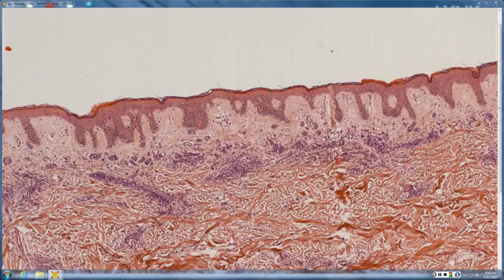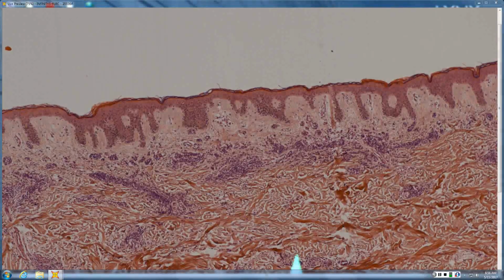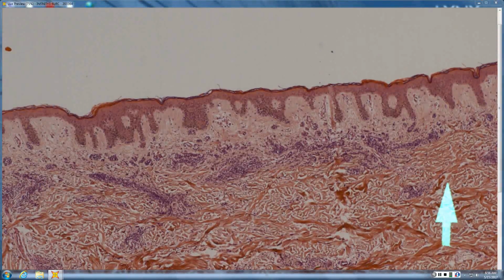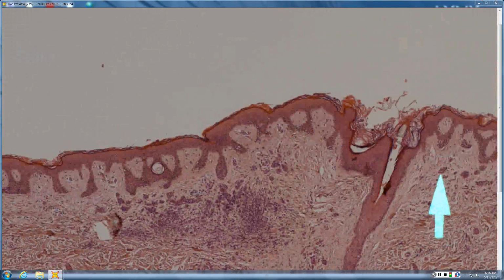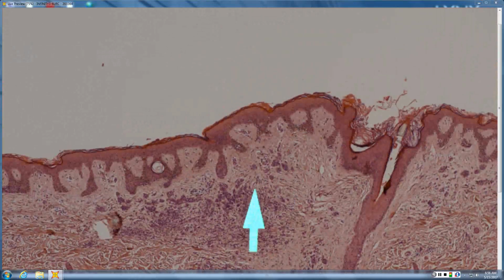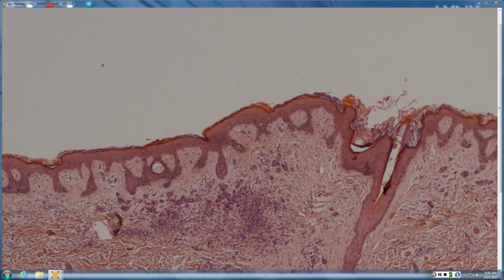As you get closer in, these are all nevus cells, so it's more of a congenital pattern. Maybe it's been a mole that's been there a long time, but I think the other cut, yeah, here you can kind of see that there are actually some little nests here, and it's maturing, so they're getting to single file, and they're more type C mature melanocytes, which is why they're so small, hyperchromatic, and looking almost like lymphocytes.